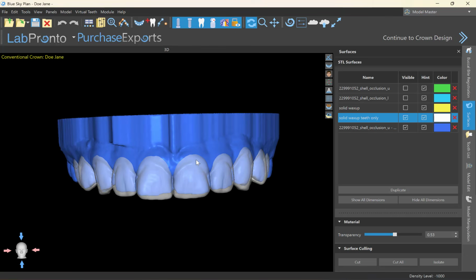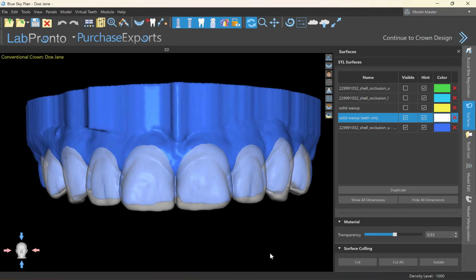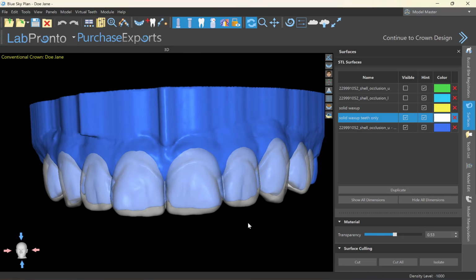I don't know the answer to that here because I don't have the patient's CT. I haven't done pocket probing down to the bone. But let's say that the bone is 3 millimeters apical here. We're removing about 2 millimeters of gingiva. We're impinging into biologic width.